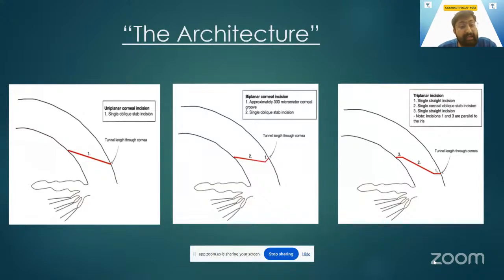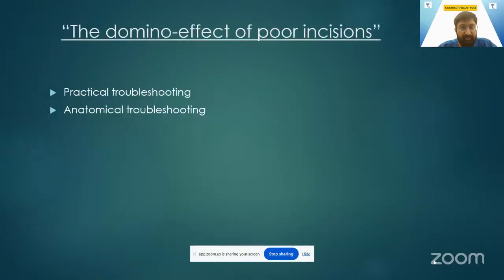Irrespective of any planes that you make, the basic rules of incision formation apply: it has to be watertight, it should have opposing margins, and it should be hydrated properly. All these common rules will apply to all the incisions possible.